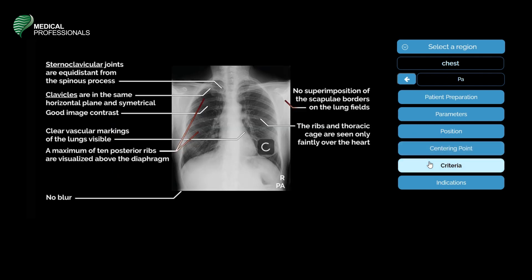Now let us look into the evaluation criteria of the image acquired. The sternoclavicular joints are equidistant from the spinous process. The clavicles are in the same horizontal plane and symmetrical. There must be good image contrast, and clear vascular markings of the lungs should be visible. A maximum of 10 posterior ribs are visualized above the diaphragm, with no superimposition of the scapulae borders on the lung fields, and the ribs of the thoracic cage are seen only faintly.